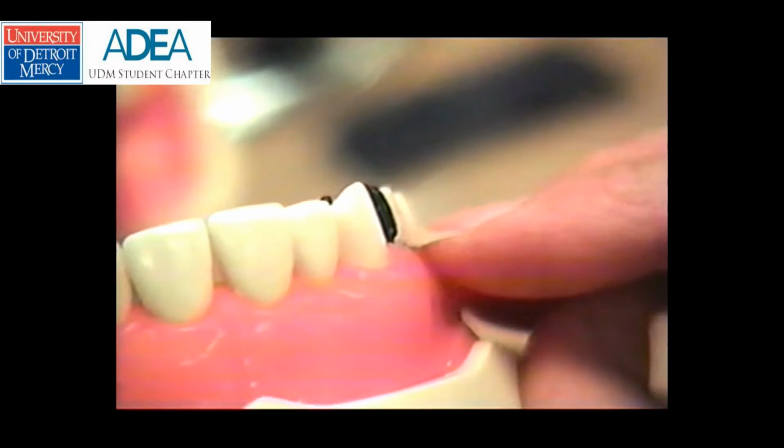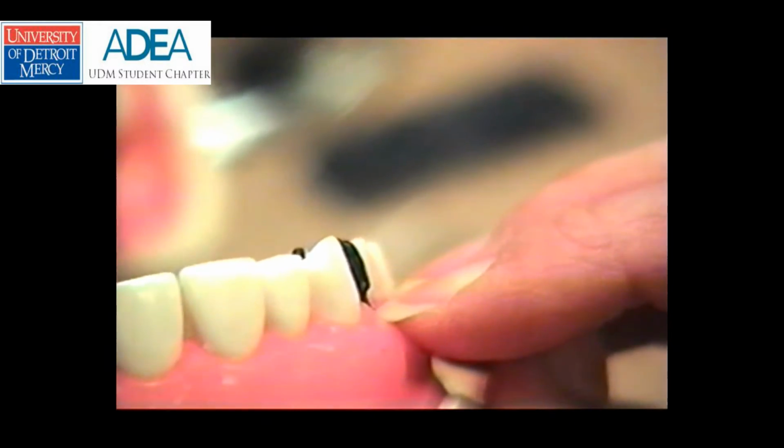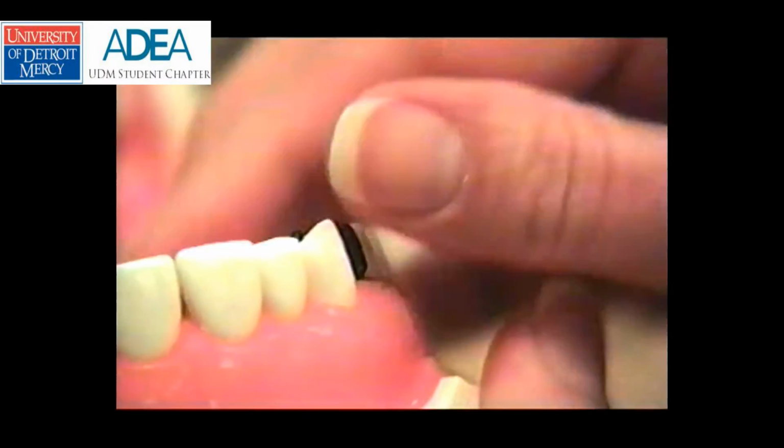We are pretty close to the ballpark on the facial contour, just with one little line of wax. We need more wax down here. Can you see that? We'd have to pull the tooth out and just add a little bit more wax there. And we're ready to go on to the next thing now.